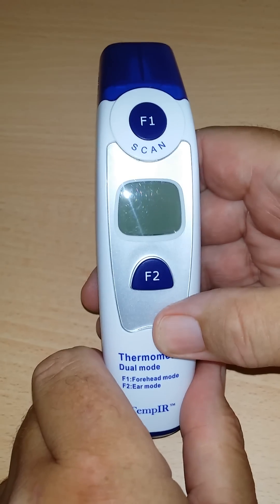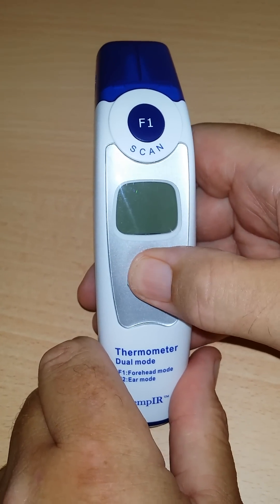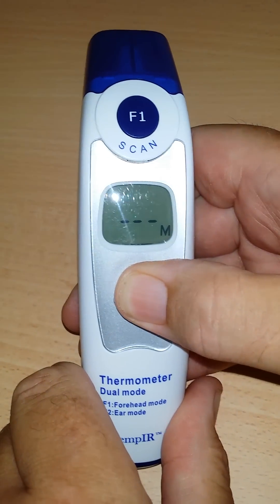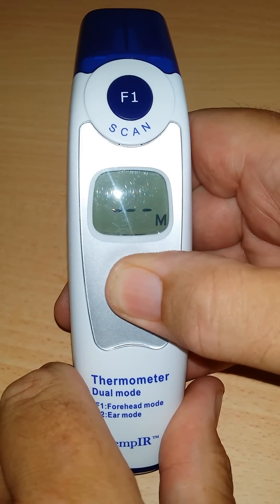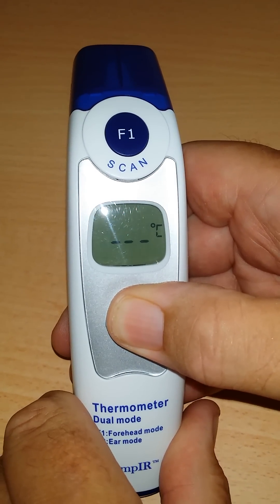Yes, hi there. What you need to do from power off is press the F2 button, keeping your finger down on the button. What you'll see on the digital readout — it takes about eight seconds — you can see there it says centigrade.